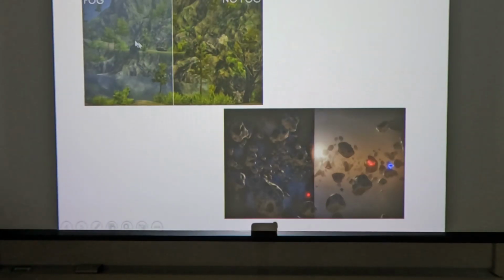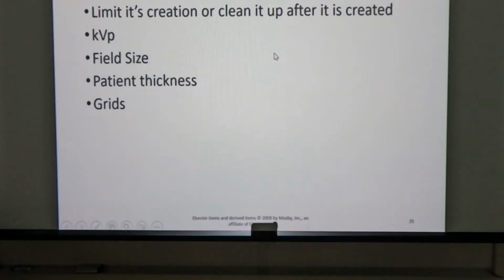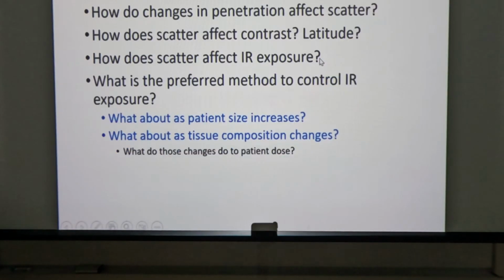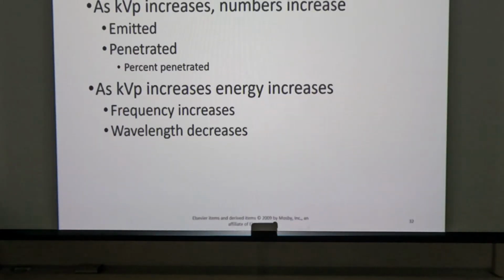If we have excessive fog, then we can't see the sharpness. We can't see the things that are actually recorded there. They're just covered up. So sharpness of recorded detail versus visibility. Sharpness: are the lines present? Visibility: can you see those lines? Right? So scatter, factors affecting scatter. We went through a lot of stuff, didn't we? And I think that's where we ended up.